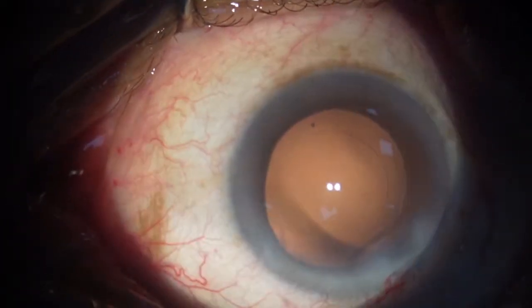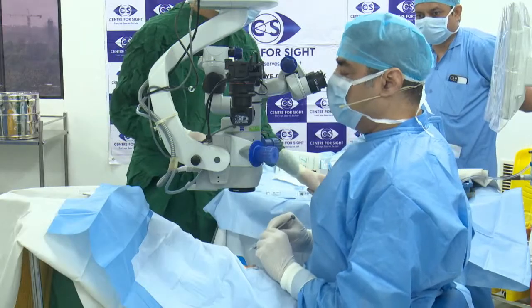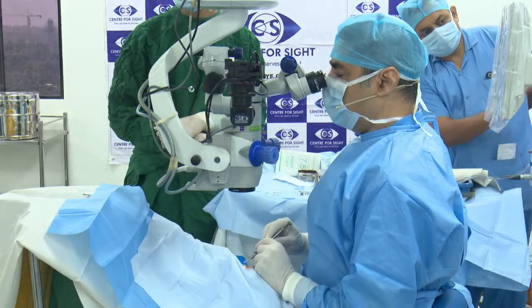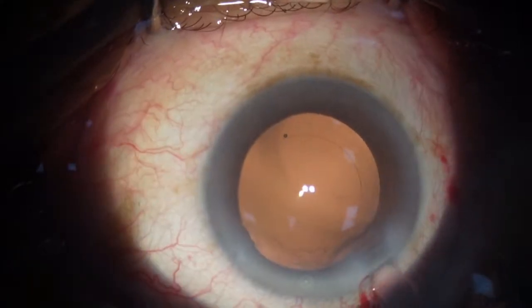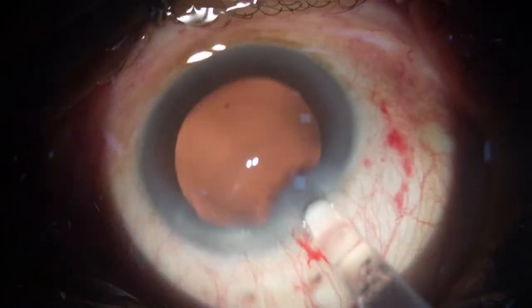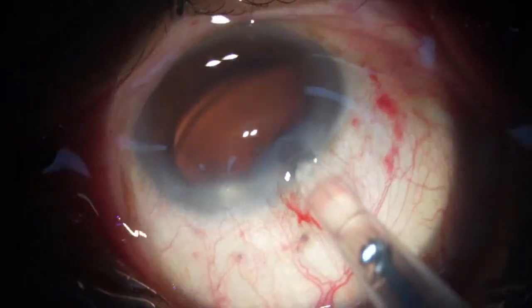I've loaded the lens onto the injector. It's the Eyhance lens. So the beauty about this lens is that it can give you a bit of near vision. That means that you can actually see the computer a little bit, and it comes at a cost of a monofocal. So it's a premium monofocal lens, and quite a bit of our practice have moved on to the Eyhance lenses.